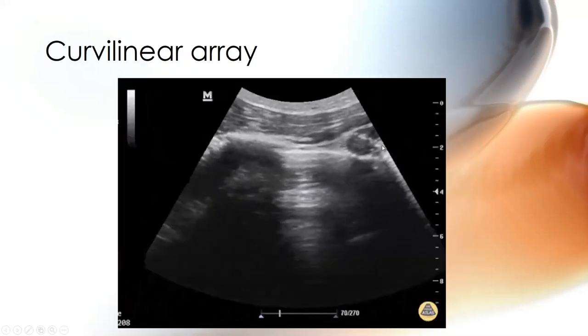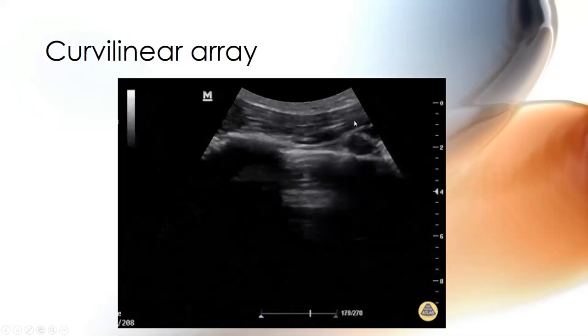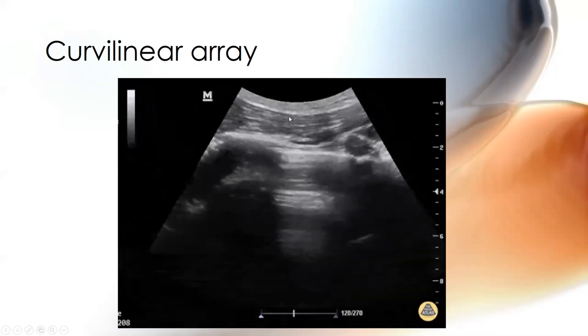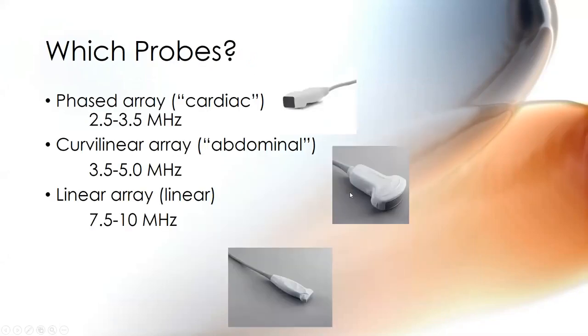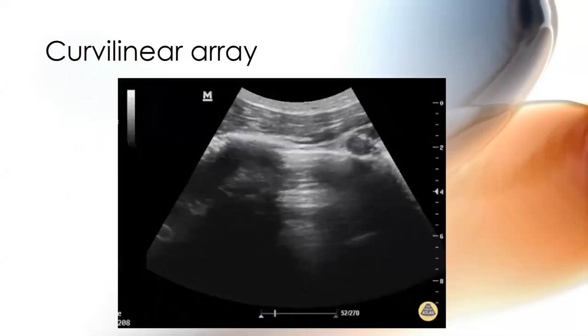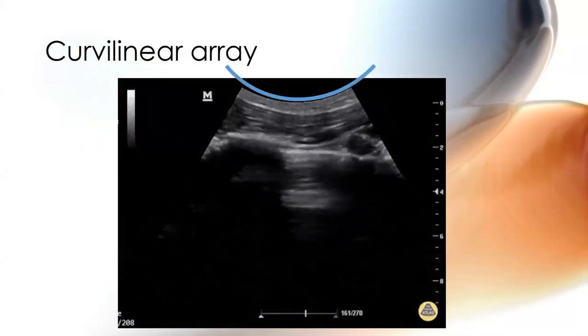A curvilinear is, as the name might suggest, a little bit of a combination of a linear array with a little bit of phased array, but the probe itself, if you look back, is a lot bigger. You can see a lot more rib spaces with that than you can this. This is why they call it cardiac, because you can fit this little square into the rib space, second, third intercostal space anteriorly to see the heart, because that's all they're looking at. This one actually can be nicer because you see more of lung. Lung's a much bigger organ. So phased array, linear array, curvilinear array. All of these images that I've shown you are lung.